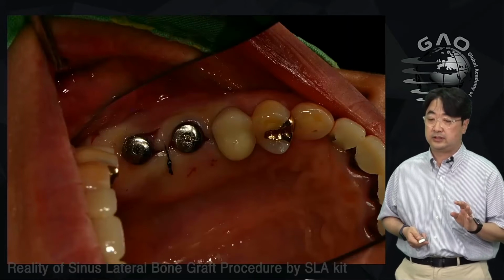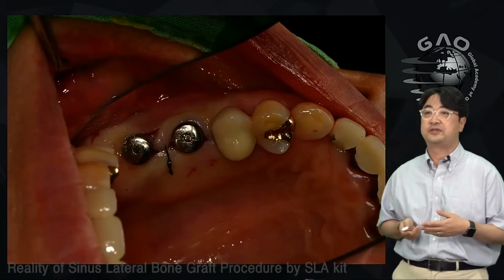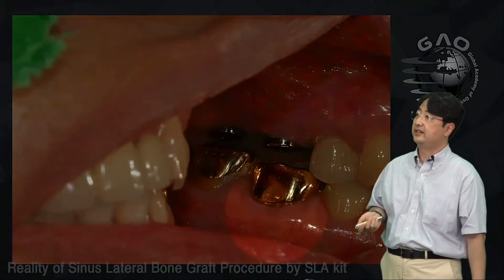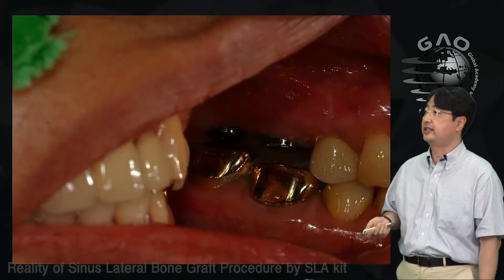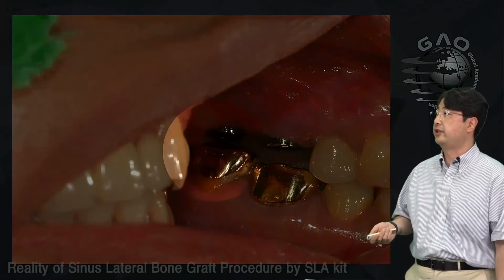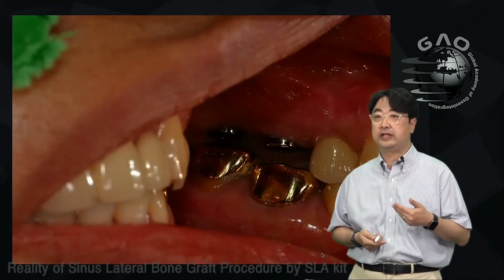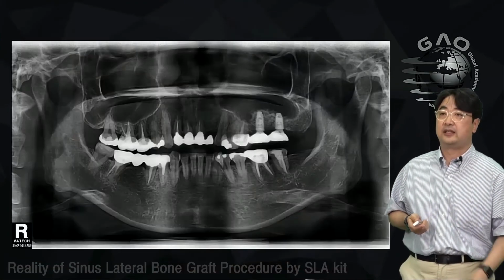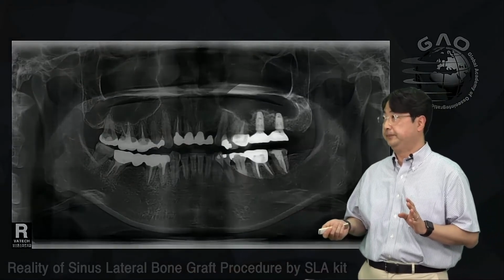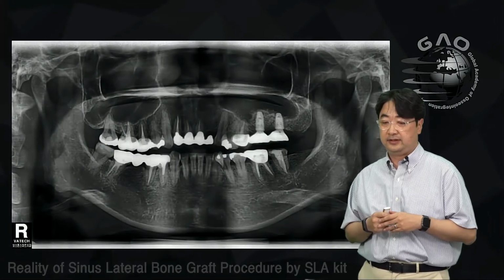Okay, so this is a clinical picture of the healing abutment after second surgery. Here you see there is not much space, right? So I decided to redo the number 37 crown, to replace number 37 to create the space. So this is the final restoration on the cast, and the panoramic radiograph after final restoration, like this.